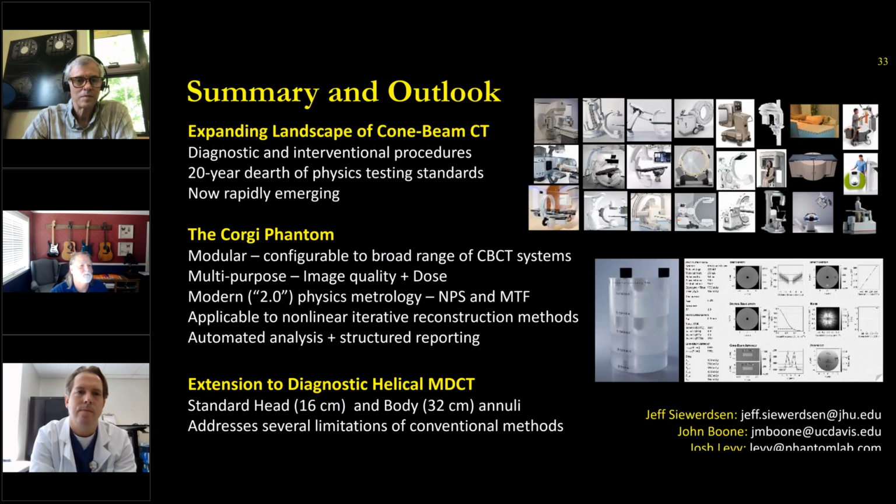So in summary, Jeff did a great overview of the expanding landscape of cone beam CT with all the different applications in both diagnostic and interventional. And what we've really experienced, and I think that RadSite wants to get to this issue, is a 20-year dearth of physics testing across these systems. And we desperately need some standards and accreditation processes to help us move into the modern era.